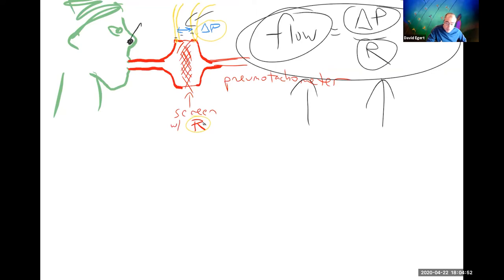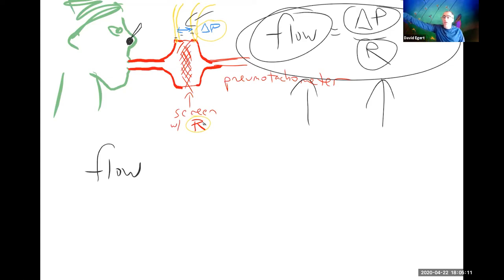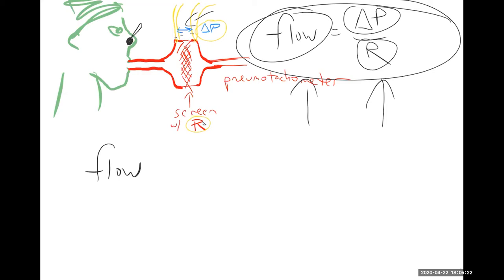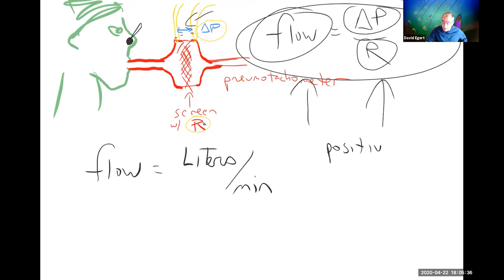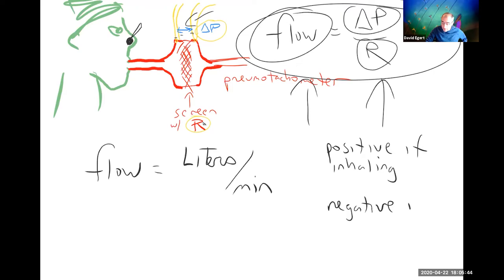So that's how the system works — it will let you breathe in and out, and it will calculate the flow based on measuring this pressure and knowing this formula. You always need to make sure you put a nose plug on, because even if you don't think you're breathing through your nose, you probably are, and it's going to affect your results. Some conventions: flow is measured in liters per minute. We're going to use a sign convention — positive if inhaling, negative if exhaling.